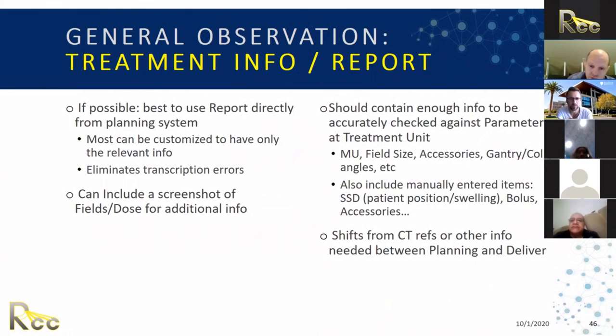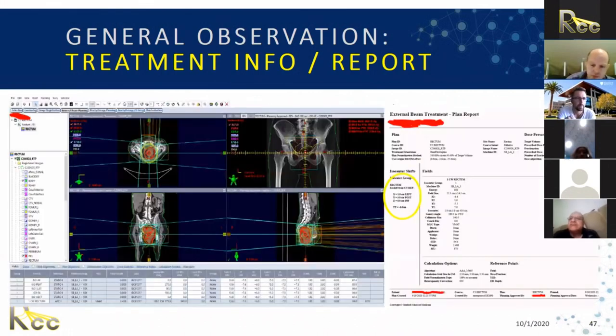Yeah, exactly. You can go ahead, Justin. So this is what we give. We'll give a report on the right-hand side. It's a little report that we print. It's got all our information, and it's got some shifts from our CT ref. We'll give those to the therapists.